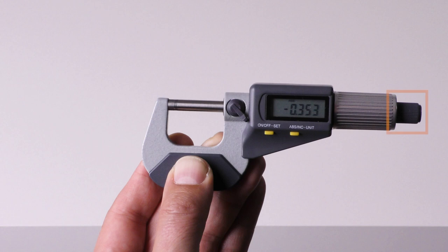In summary: Use the quick drive to get close to the surface which you want to measure and then use the ratchet until its torque mechanism is triggered.